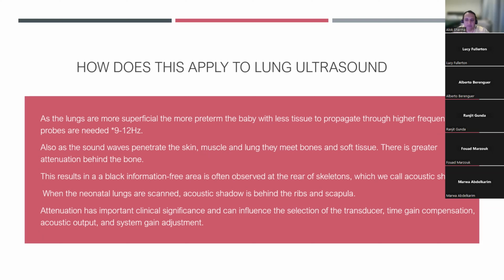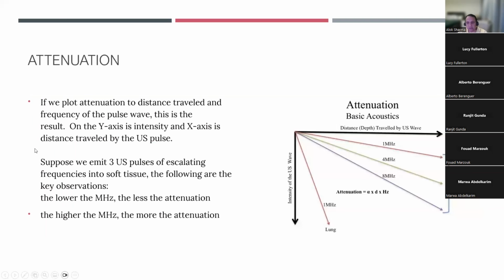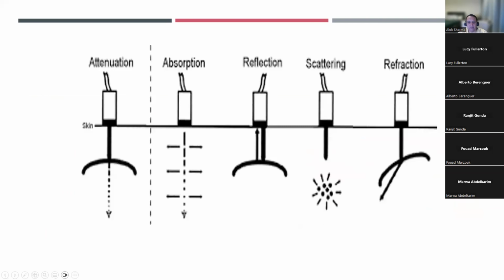No. So it's a lovely question, and it's important that we focus on it. So as I said, machines that we used in yesteryears would help you to change the focus. So a simple example is I'm going to go back to that image that we have. Now this is pleura. So I'm just going to use my cursor, laser pointer. This is pleura, and this is my area of interest. Now over here, you basically have tissue.